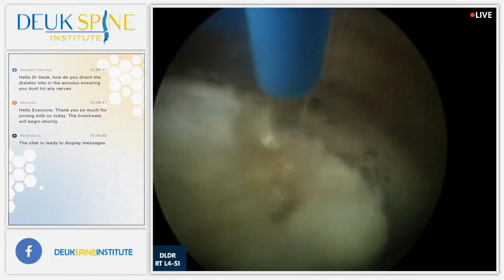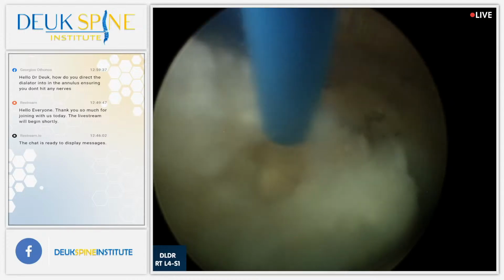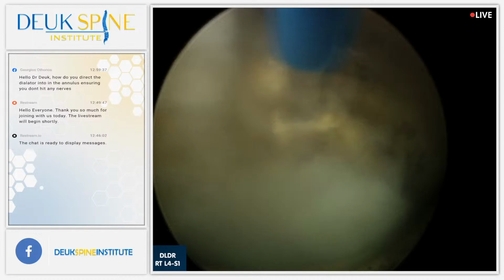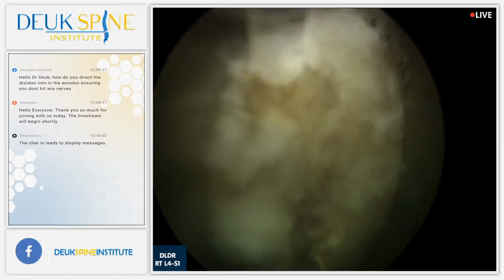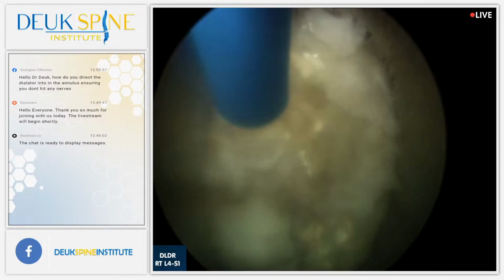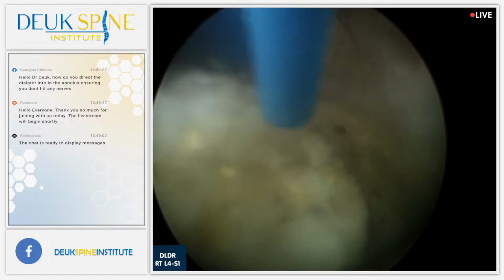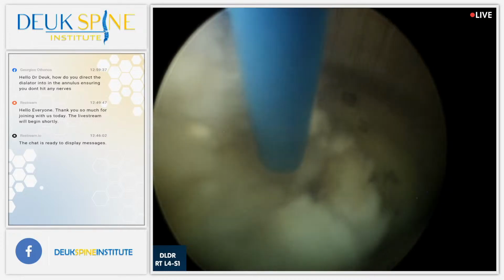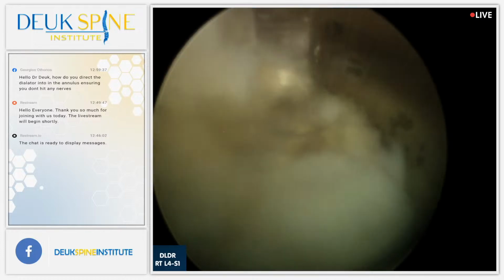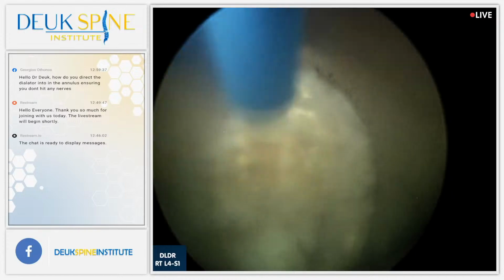So the key is to place the spinal needle properly with the patient, number one, awake, so that they're going to tell me if I'm too close to the nerve. They're going to complain about pain going down their leg. Second of all, I know my anatomy very well. I studied hard, learned my anatomy. I know exactly where everything is. And I make sure that I use my X-ray machine to navigate the needle to the right spot through the right area. So it's kind of like sailing a ship through a reef, right?